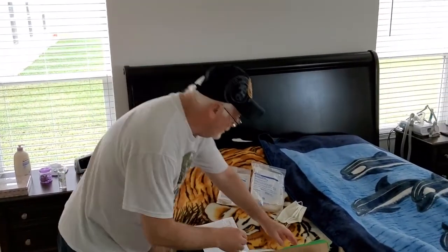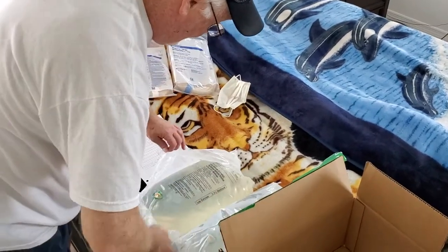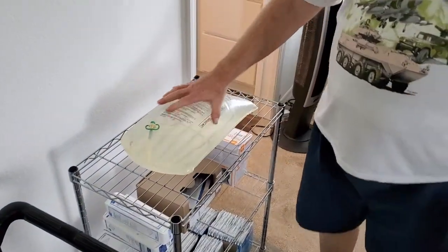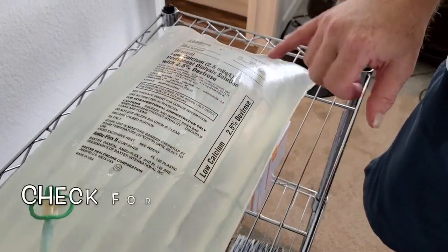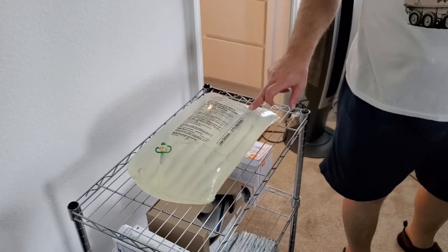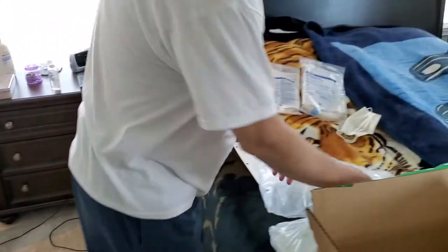I already have my mask and my dialysis solution prepped out on the bed. They have little slits up here in the top of the bag — you can just pull down and it should open up. What you want to pay attention to is clarity of the solution, and you're also going to check the expiration date. If this thing looks bad, it probably is bad, and you definitely don't want to put anything in your body that doesn't belong there. This one expires August 2022 and the solution is clear — that's the first bag.